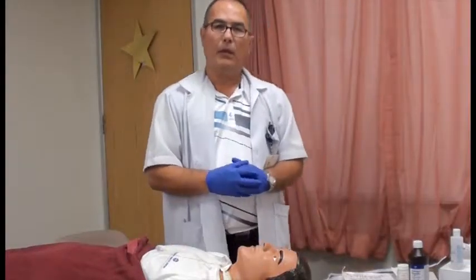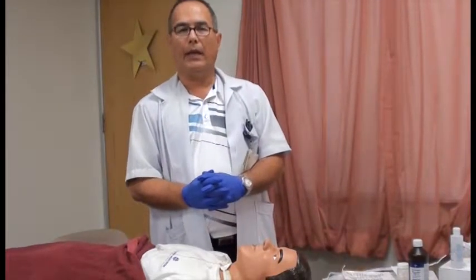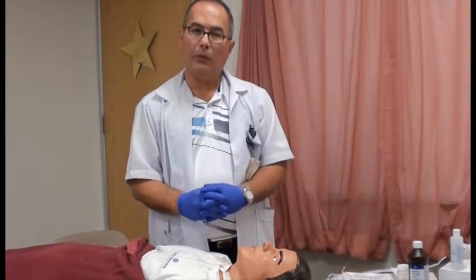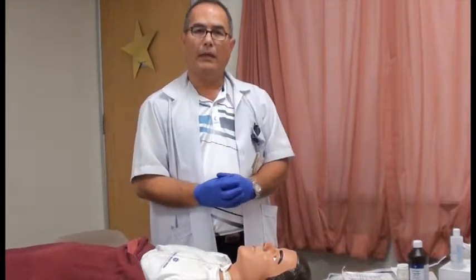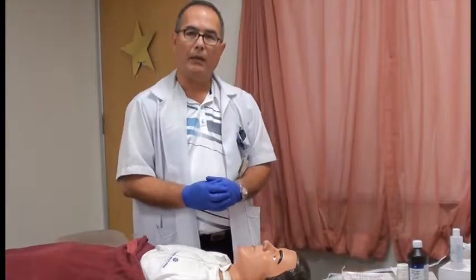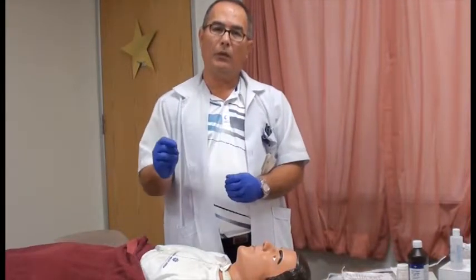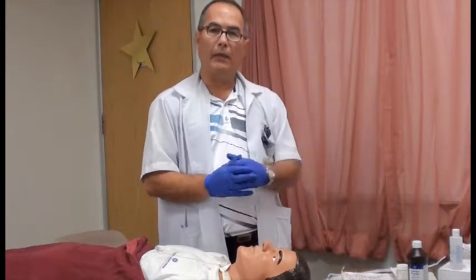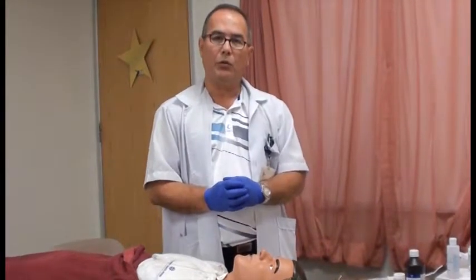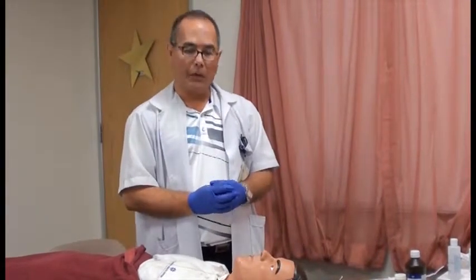The second point that I want to make is that when we see the patient in their home, this is not a sterile technique, rather it is an aseptic or clean technique. The reason is because the patient in the home has a disposable inner cannula. If the patient has a permanent inner cannula and we're cleaning that, then it's a sterile technique, because we need to make sure of the sterility of the inner cannula when we're cleaning it. As I said, the cleaning kit in the tracheostomy kit has all those necessary tools to clean the inner cannula. But at this point, most of our technique will be clean or aseptic.